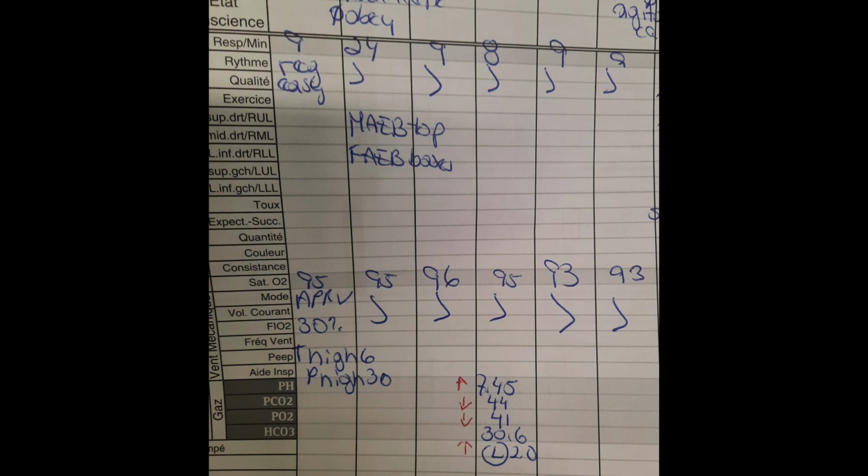So again, this is why I am an advocate of using APRV, because the lung is an organ that uses diffusion. So why not use diffusion in patients with good diffusion capacity in the alveoli so that we can move that chest a lot less, especially when we know that the aeration, especially in the dorsal, even though we've recovered a certain amount, is not perfect.